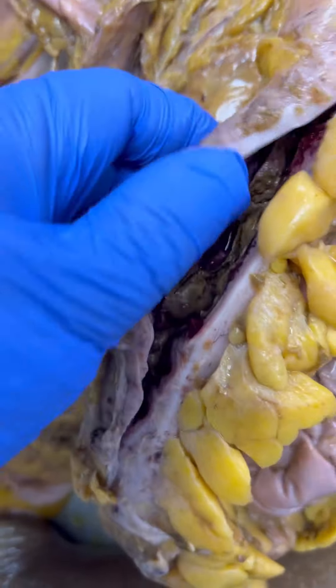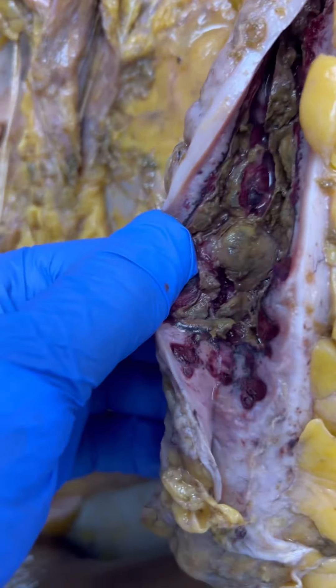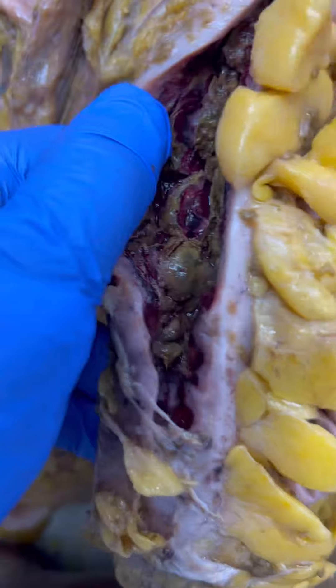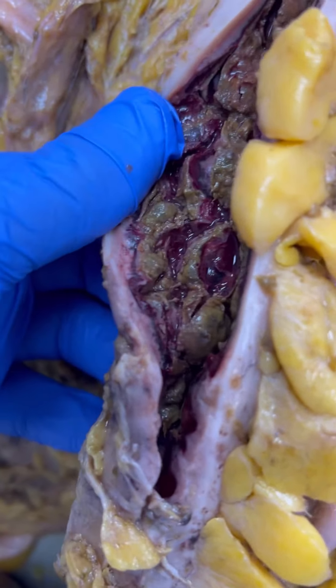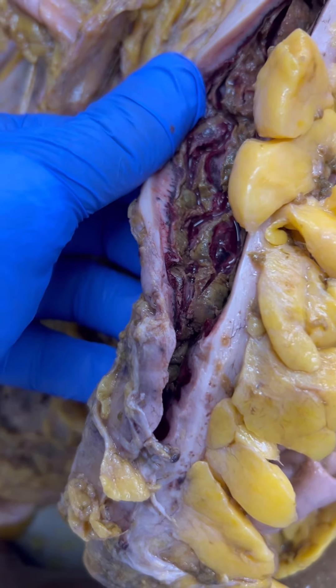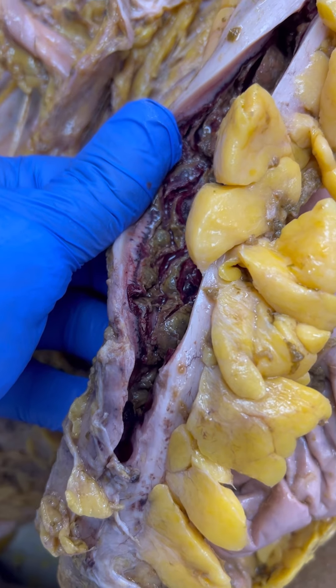I expanded the examination of the colon. This is the distal colon, and sure enough, that hemorrhagic mucosa extends the full length of the large bowel. So I am concerned about ulcerative colitis. We will say more about that once we see the microscopic of this, but I am concerned about that.